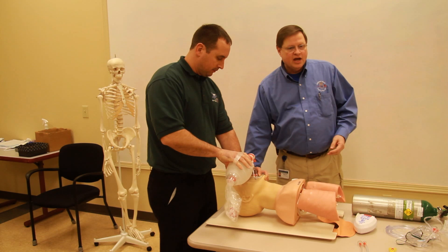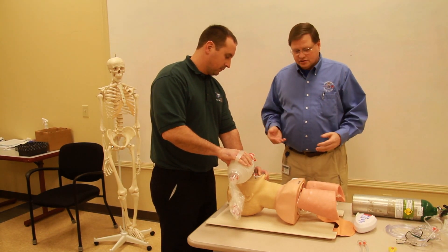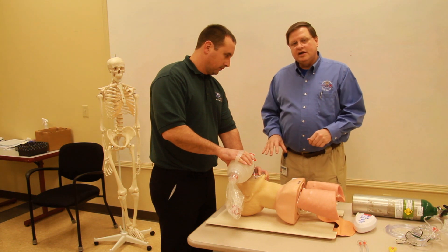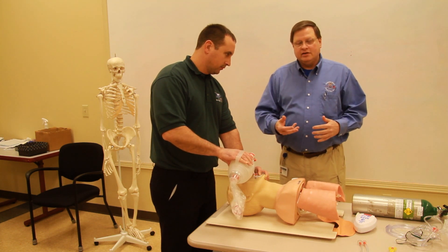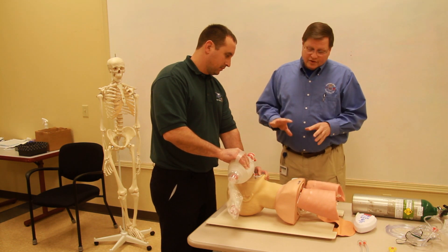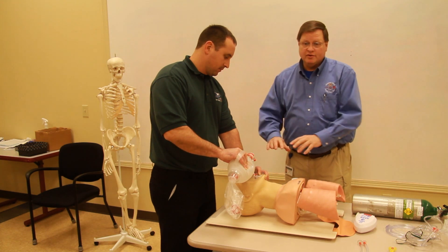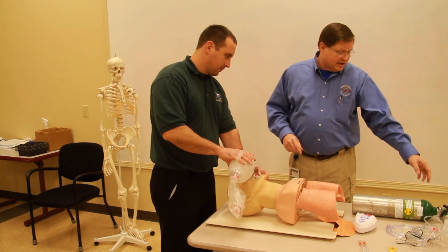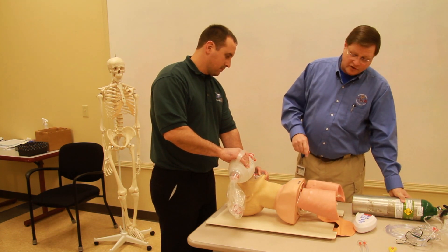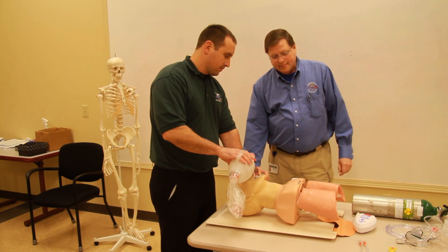As with any advanced airway, we call in for physician's orders. I want the physician to know some of the contraindications — we only use this airway in apneic patients who are not breathing. My partner puts the patient on high-flow oxygen to fill up the oxygen reservoir.